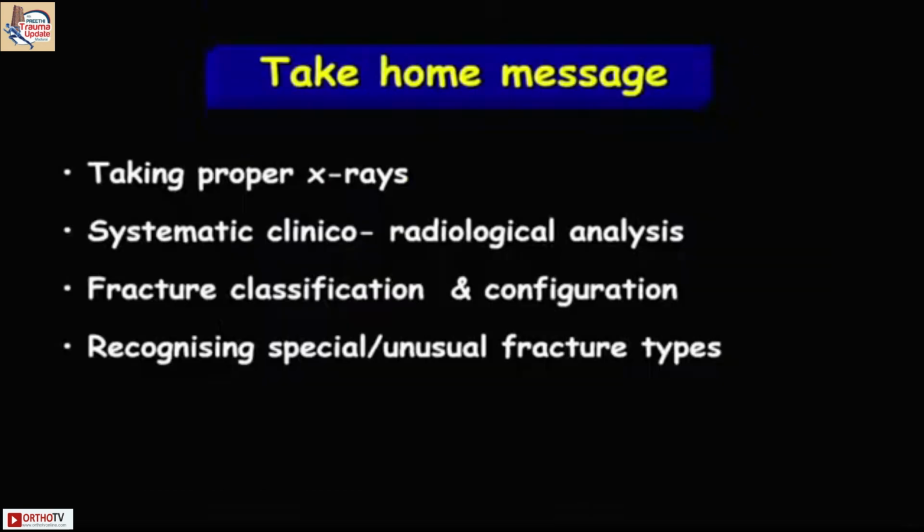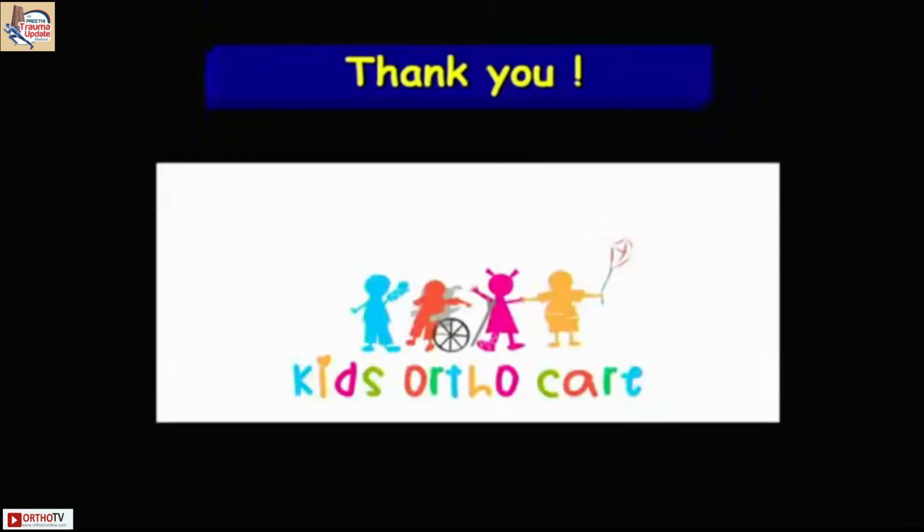So take home message is a proper X-ray is important. You have to do a proper clinical radiological analysis, classify properly, and configuration of the fractures are also important in planning the fracture fixation. Finally, don't forget to recognize the special and unusual fracture types.